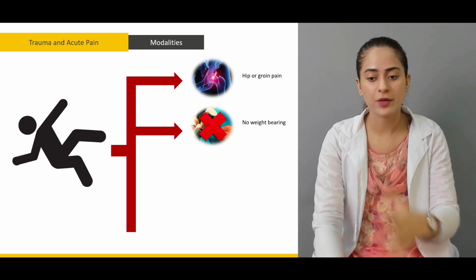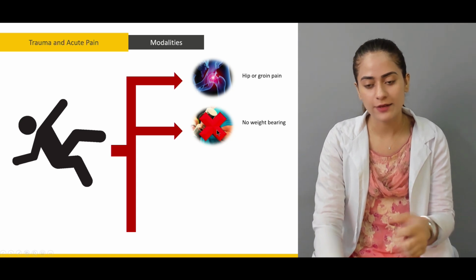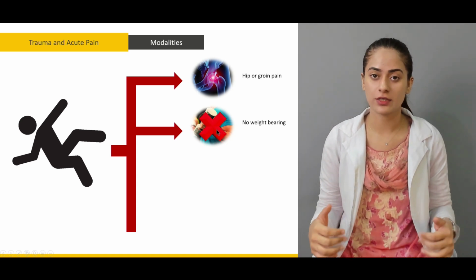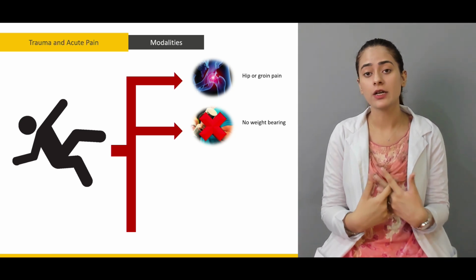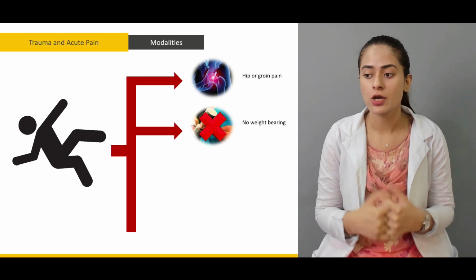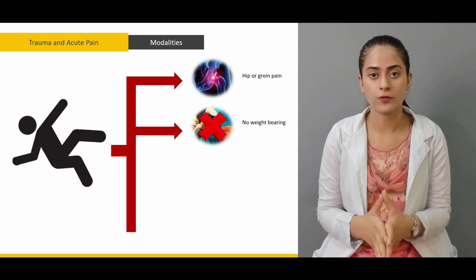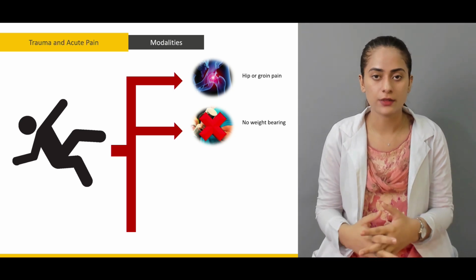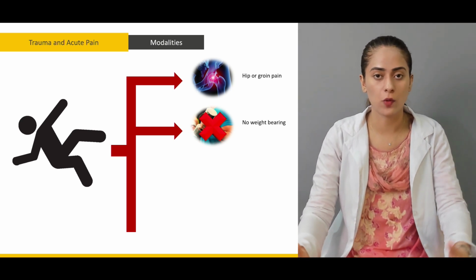And so weight bearing here, there is a person who has weights in his hand, but it's also when you actually stand on your feet, you're in a weight-bearing position. As we're talking about the hip, the weight-bearing position is any anti-gravity position in which your lower limb is bearing the weight of your entire upper body and also its own weight against the gravitational force, right?